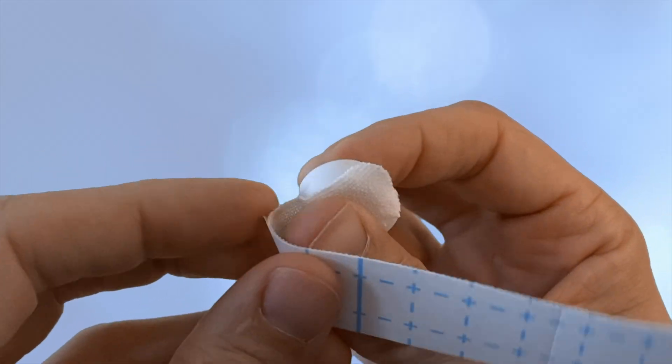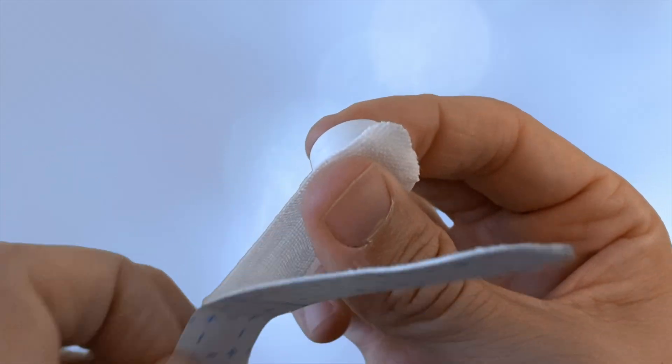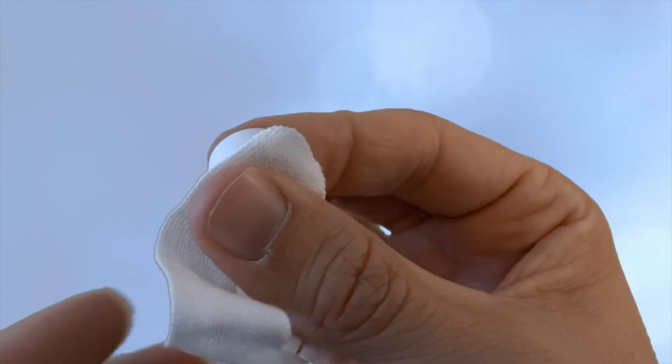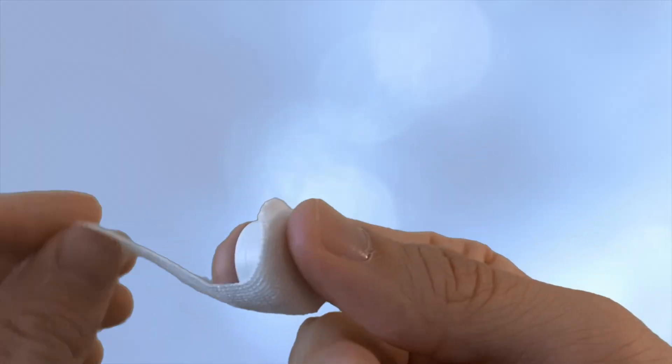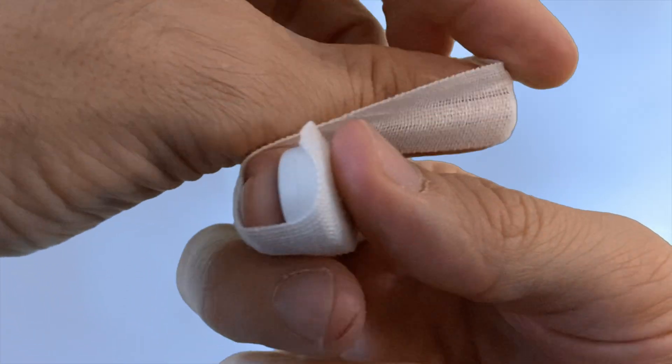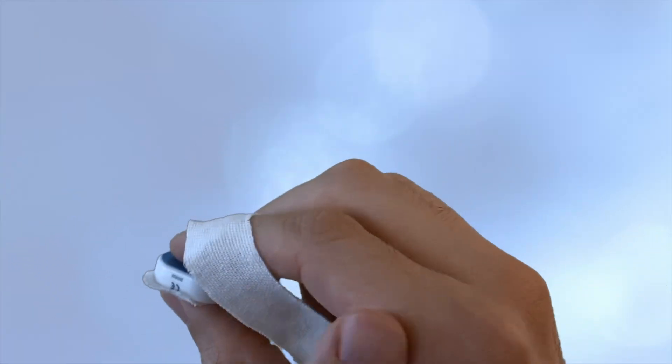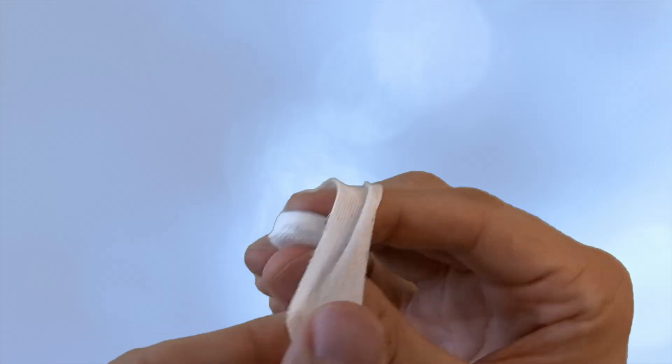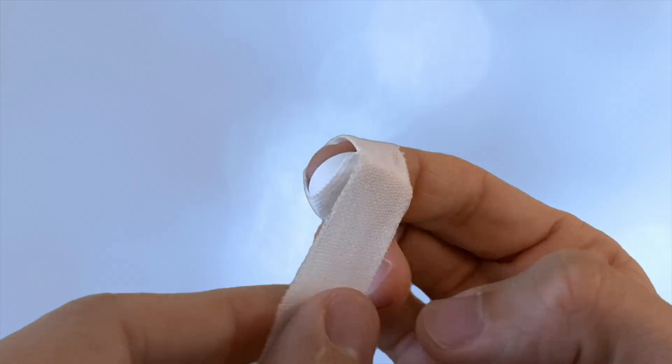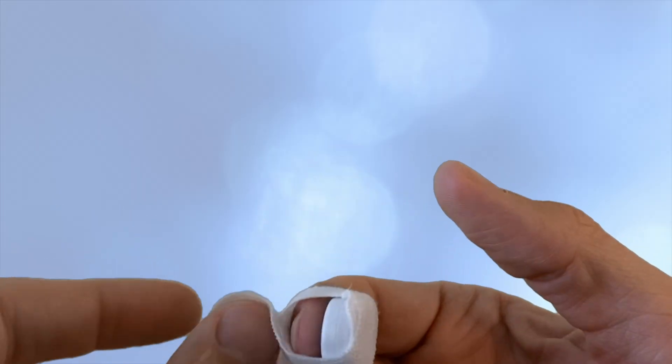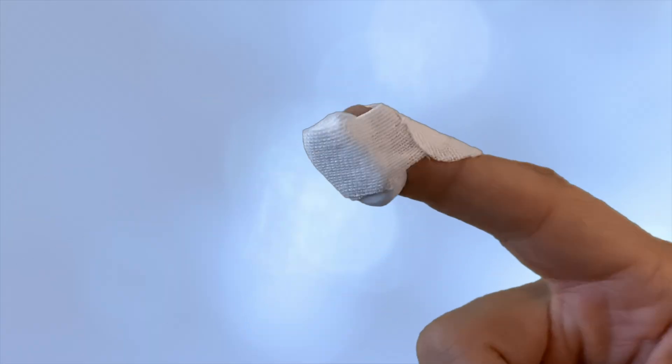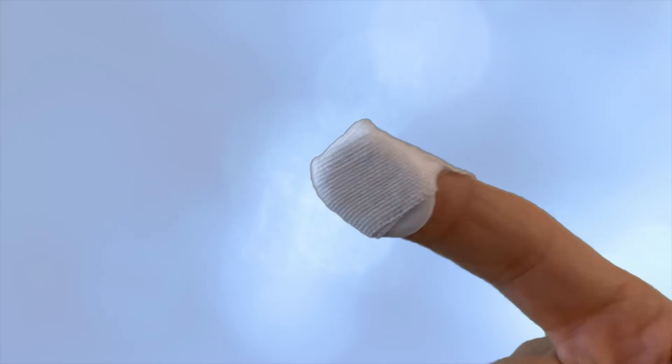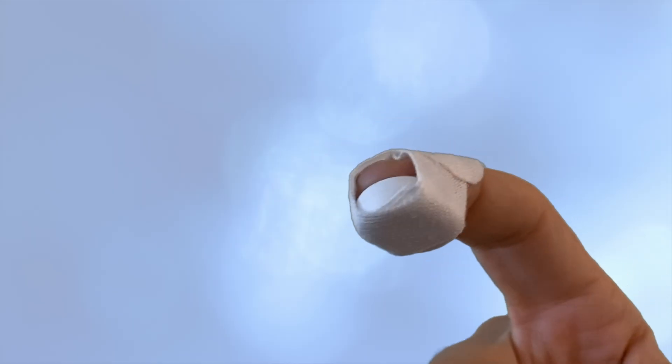Place the device on your finger like so, with the sensor light touching your skin. Then, simply wrap the adhesive strap around your finger. Don't wrap it too tight, but make sure the device is secure enough that it doesn't move.